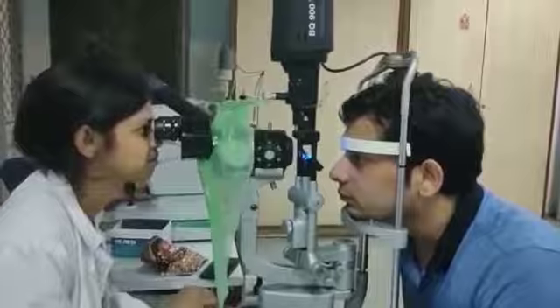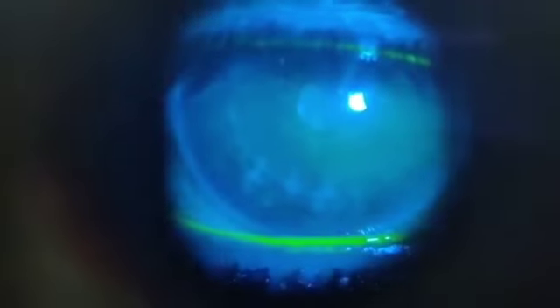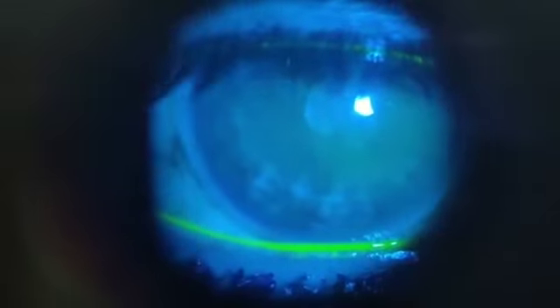Once the eye is focused, the patient will be asked to blink, then hold their eye open until instructed to stop. We will observe the eye through the microscope while measuring the time in seconds, either by using a stopwatch or by counting. We will wait for the first appearance of a dry spot on the patient's cornea. Once the first dark spot is observed, we will stop counting and record the TBUT result.